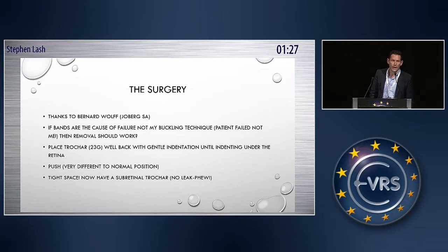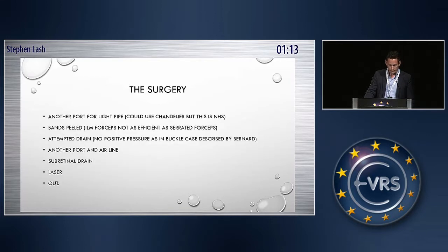So I placed the trocar well back under the retina. Thank goodness it didn't leak — we have the Alcon ports, which are a bit leaky. It feels a bit different to putting a trocar in the normal position, and then once you're under the retina, you can peel. We do have chandeliers in the NHS, but they're expensive, so we're not allowed to use them. So I just used a normal light pipe, and I had to make some modifications, because Bernard does it with a buckle, and therefore when he's draining subretinal fluid he can exert pressure, whereas I found when I tried to drain, it was not draining. So I made another port for a light pipe.